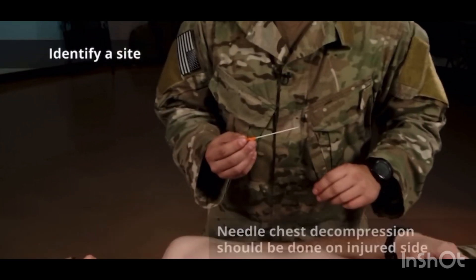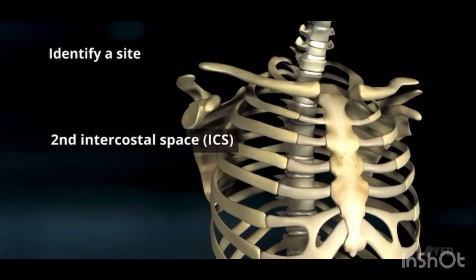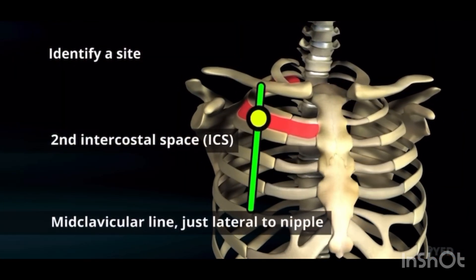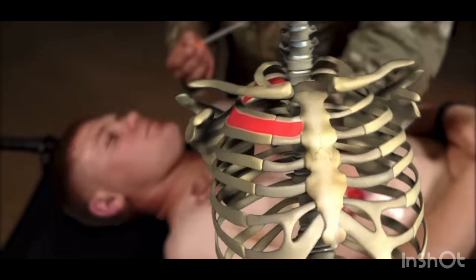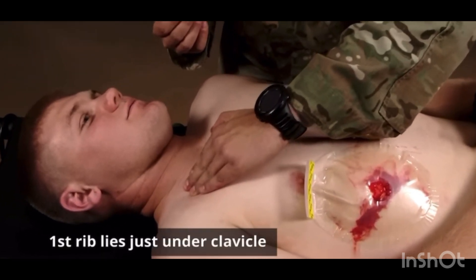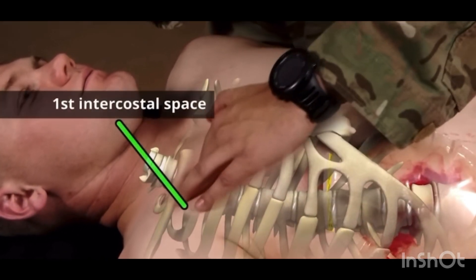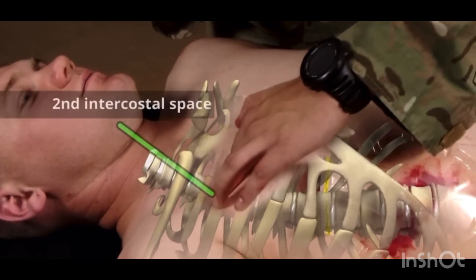Step 1: Identify the insertion site and gather all necessary equipment needed for the procedure. You can palpate the ribs to look for the correct location, or alternatively you can look for the angle of Louis, which is in line with the second intercostal space.